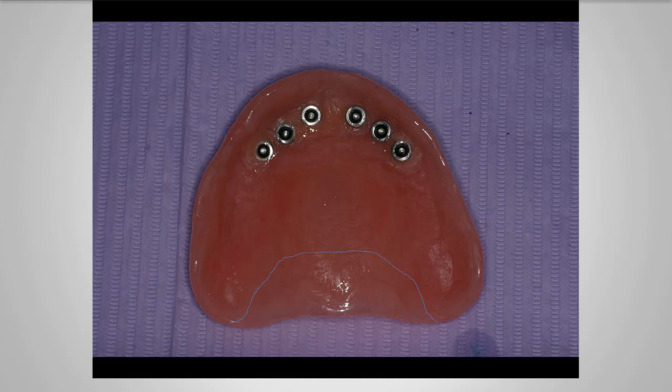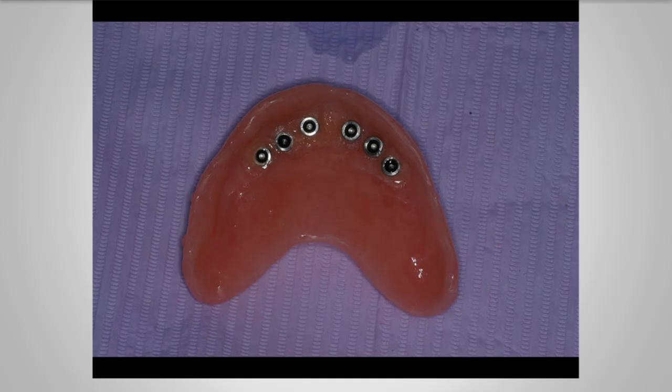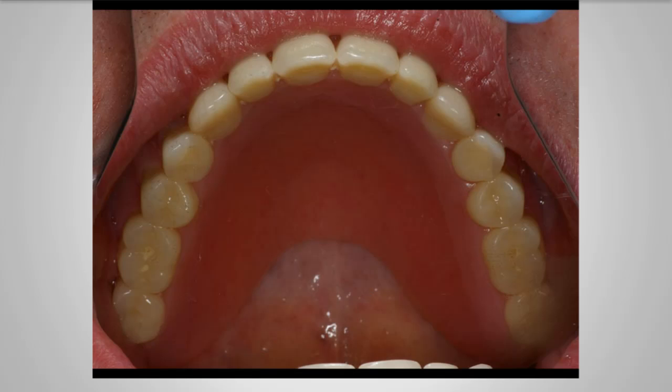Once the material has cured, we'll go ahead and relieve any areas that may be some excess flash. And now that he has a more retentive upper denture, our goal is to relieve this posterior palatal seal that was causing him to gag, as seen here. Now, in the patient's mouth, we can clearly identify that the palate is somewhat free of this denture.